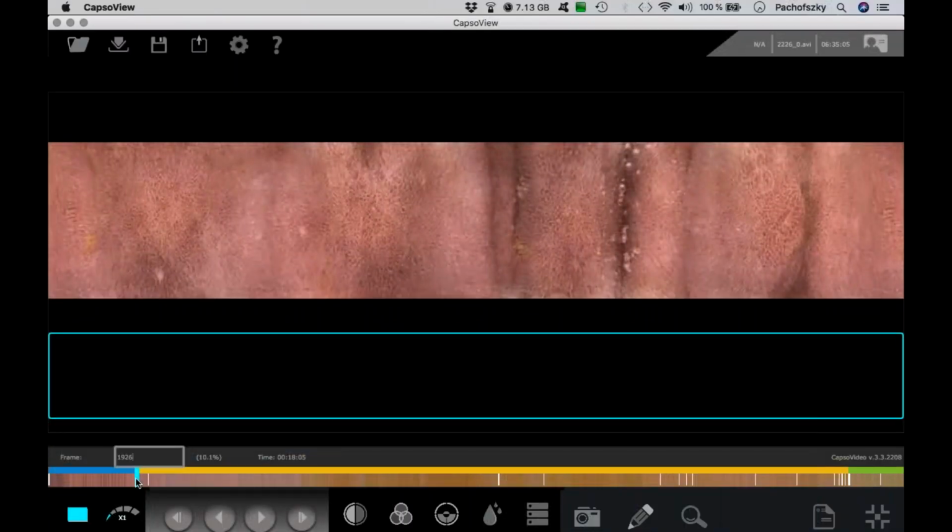I will need for this case 15 minutes, 5 more minutes for reporting. So overall 20 minutes for the total case. Then 12 to 15 minutes for the download. So I will be ready within 30 to 35 minutes, including download, looking at the case and reporting.